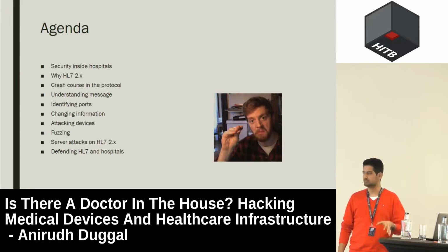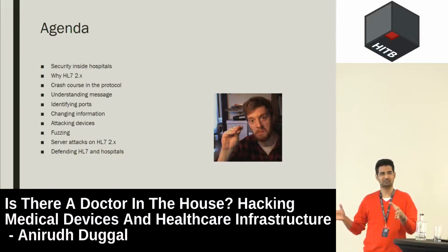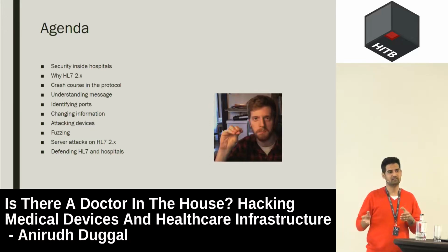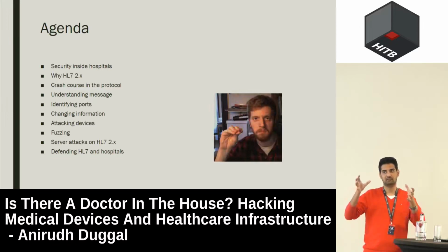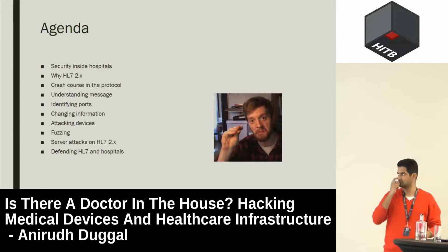Just a warning: if you're pen testing medical devices, do not do it in a live environment. If you're inside of a hospital and you're doing a pen test, tell them to isolate the environment, because these scans will take down devices. They can also disrupt the functionality of other devices that are not actively connected to it. They will be connected to the same network, and you might not be testing them, but you can crash other devices using this protocol also. So be a little careful while you're pen testing these devices.